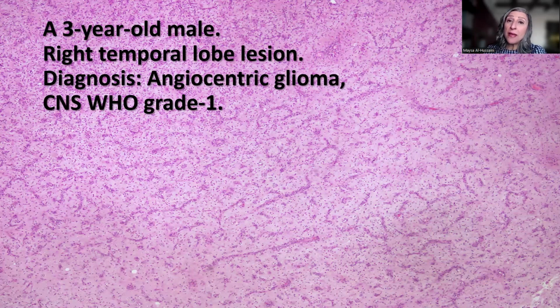And remember that ependymoma usually is a circumscribed tumor, whereas angiocentric glioma is an infiltrative tumor that can be further highlighted with a neurofilament protein. So despite similarity to ependymoma, somehow morphologically and by immunophenotype, the tumor is completely separate from ependymoma, at least as far as the evidence that we have until now, and it is assigned a CNS grade 1 tumor. I hope you find this tip useful in your daily practice.